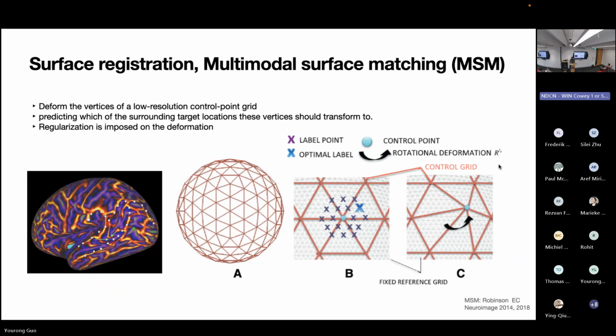It's going to reach beyond the limit of neurobiology. So here clearly there are two neighboring control points trying to go in different directions. And now it's trying to squeeze this gyrus into nothing so that it will disappear and match better to the target template. Actually, we can't let it happen because you can't just change the structure of your moving image, right?